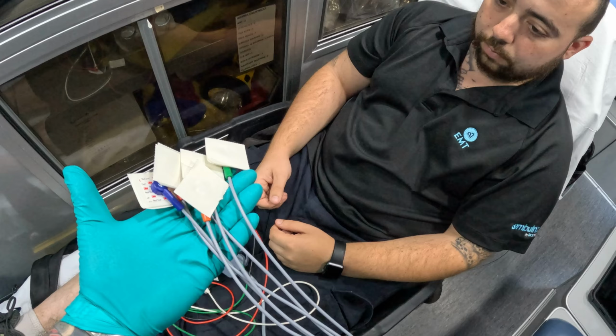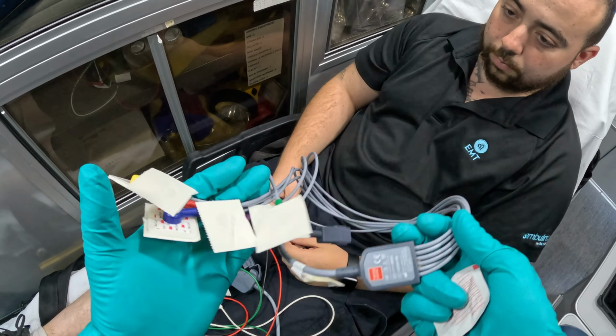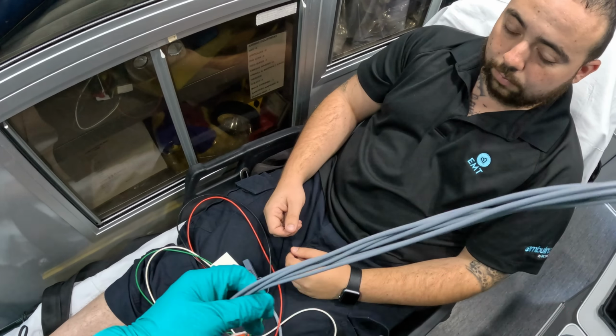So the first step that you're going to do is you're going to get your cables, and you're going to connect these electrodes, right? So we already pre-connected them. These are your limb leads, right, that I'm holding. And these are your chest leads that get placed on the chest, and we're going to talk about the anatomical landmarks. Another name for them is precordial leads, right? So they basically look at the picture around your heart.